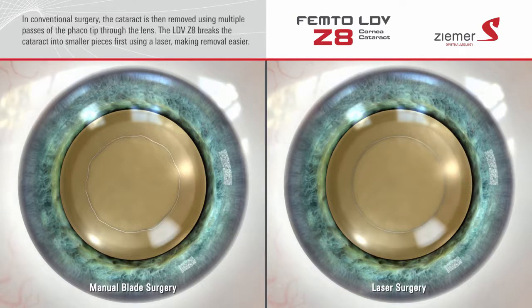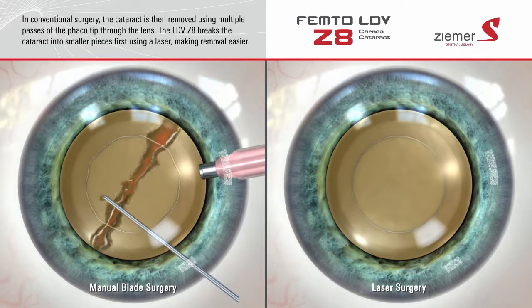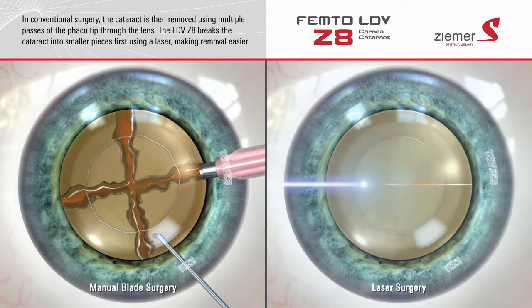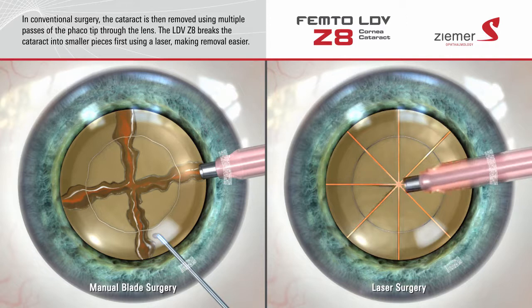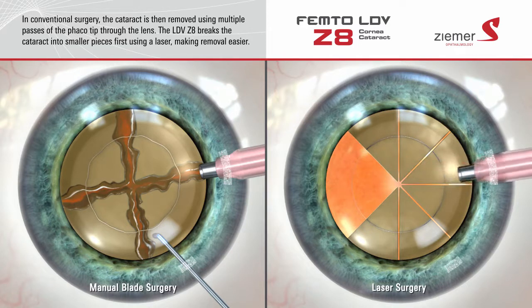Finally, the cataract is removed using a procedure called phacoemulsification. In traditional surgery, the cataract is removed using multiple passes of the phaco tip through the lens. The Zeemer Z8 uses laser light to pre-fragment the cataract into small segments, making it easier to remove from the eye with less movement of the phaco tip. This could potentially diminish the possibility of the phaco tip damaging surrounding tissue.